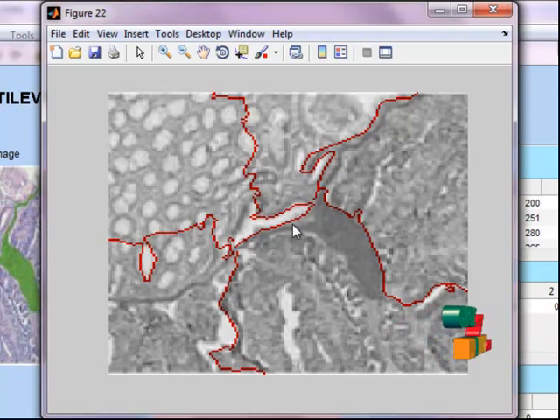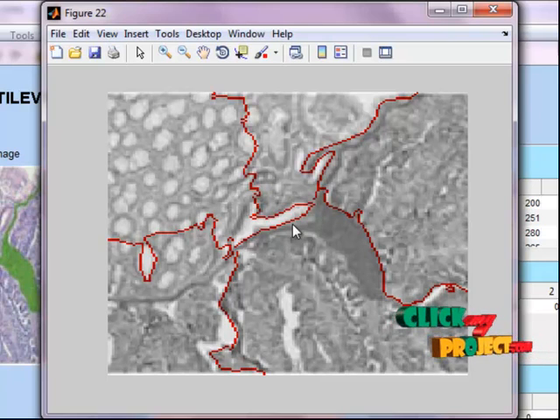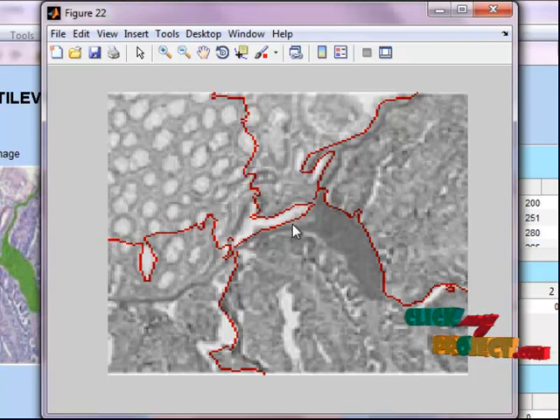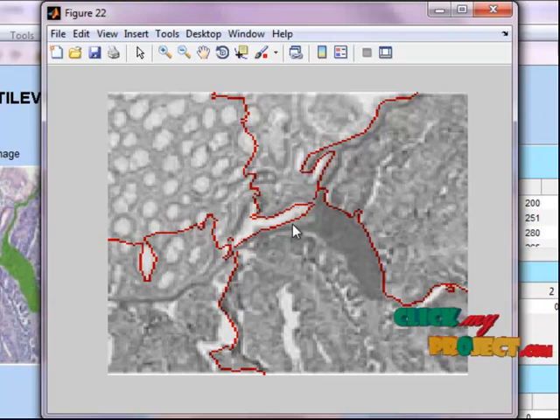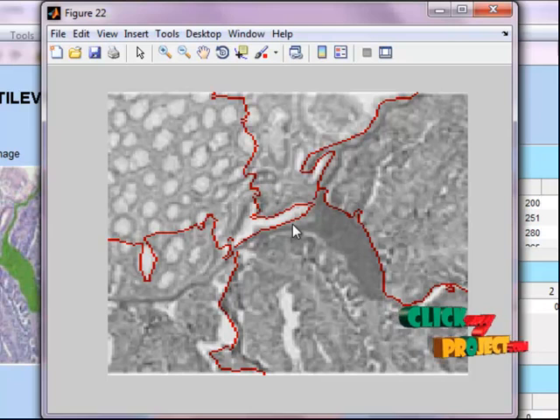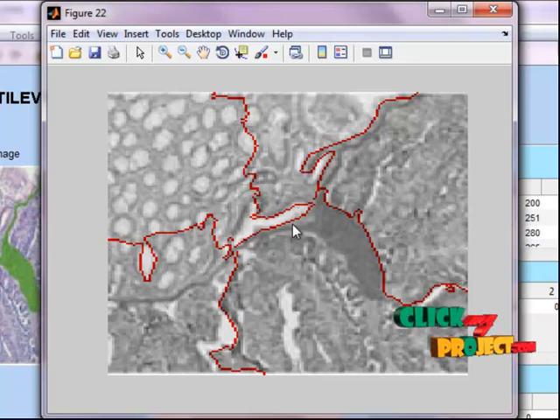Next are the original image segmentation results. The proposed multi-level segmentation algorithm has two main contributions: the introduction of object co-occurrence features and the use of multi-level segmentation. Graph run-length features are used to quantify the objects and achieve segmentation by multi-level segmentation. In the second approach, we use the same co-occurrence features to quantify the objects but achieve segmentation by region growing. Thank you.